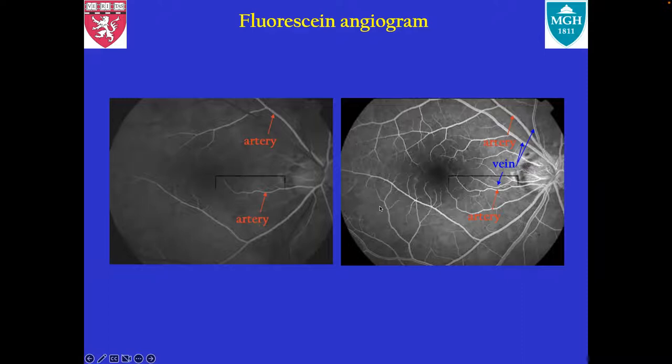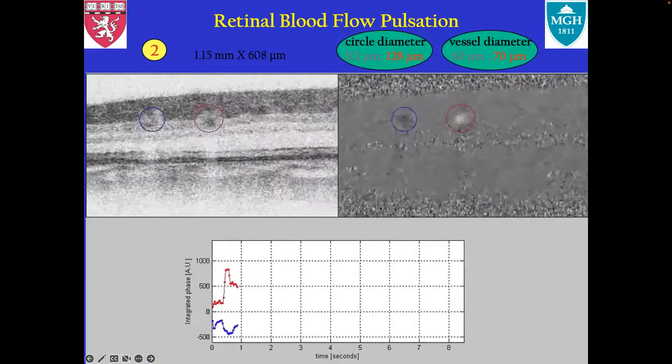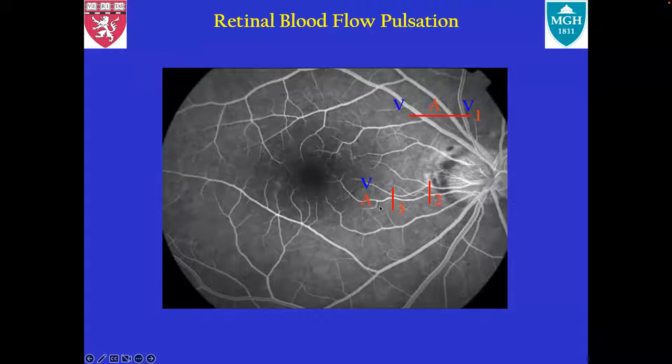And we can do a measurement along these two locations. I think I'm only showing one of them, but the nice thing is they're very close together, an artery and a vein, so you can look at the flow in these two locations. It is position two, so it says two. It's this one actually. We're looking here.